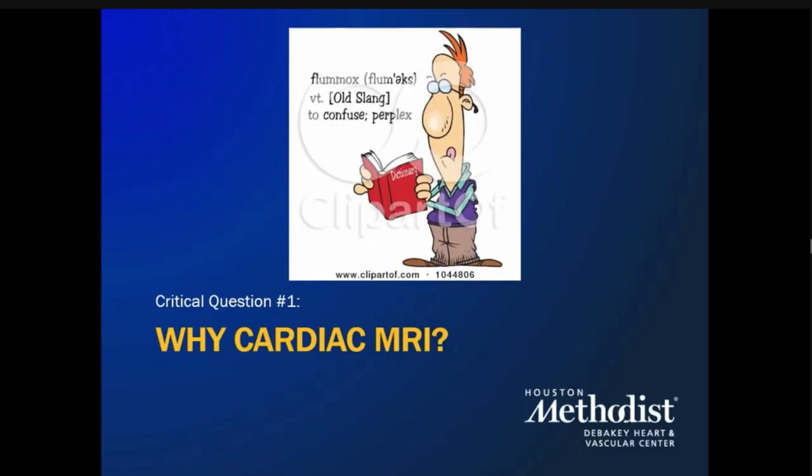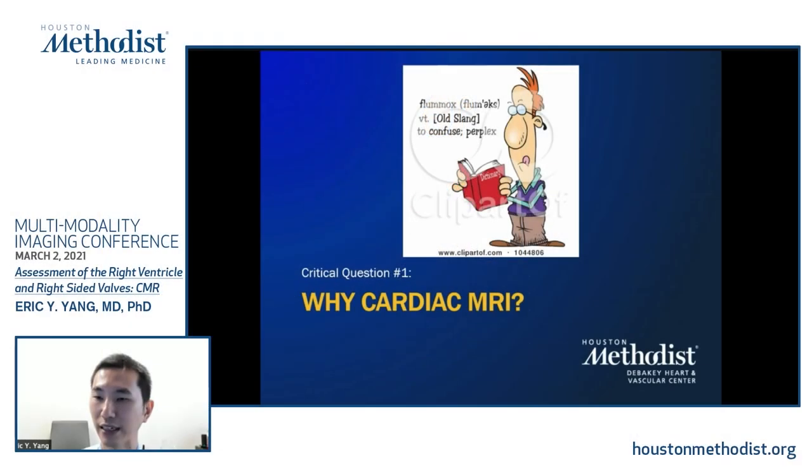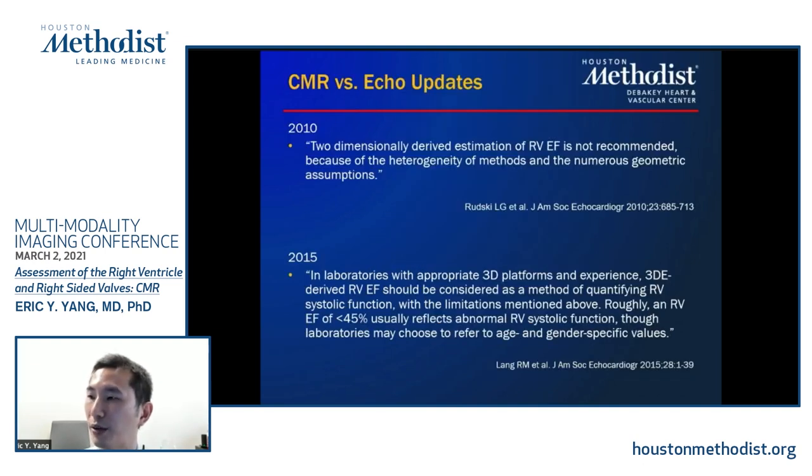Okay. So then the question becomes, why do cardiac CMR? Because if you're going to pick a different imaging modality to image a patient as opposed to echo or CT or any other modality, there must be a reason why that imaging modality is used, why there are certain advantages with that modality over others. Back just a decade ago, the original guidelines for assessing the right heart actually argued against using echo for RVEF.